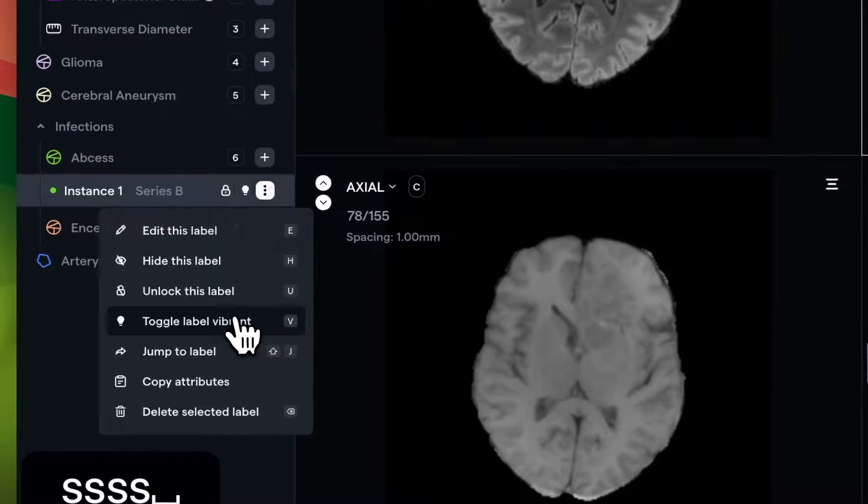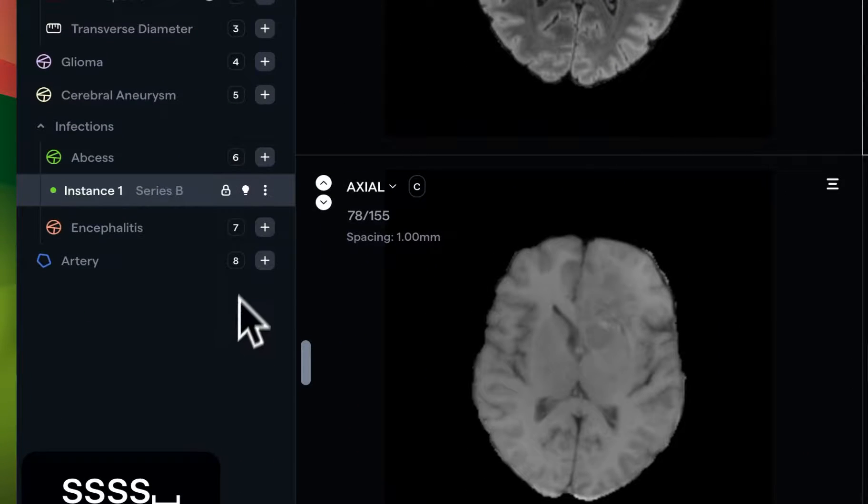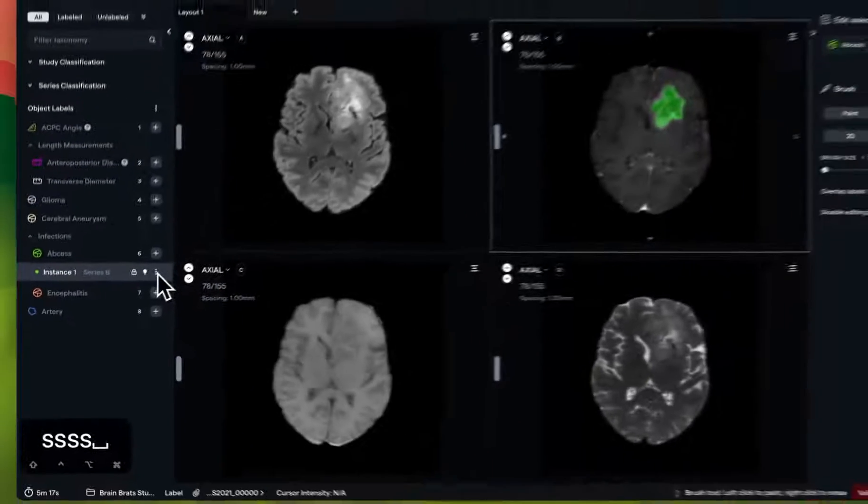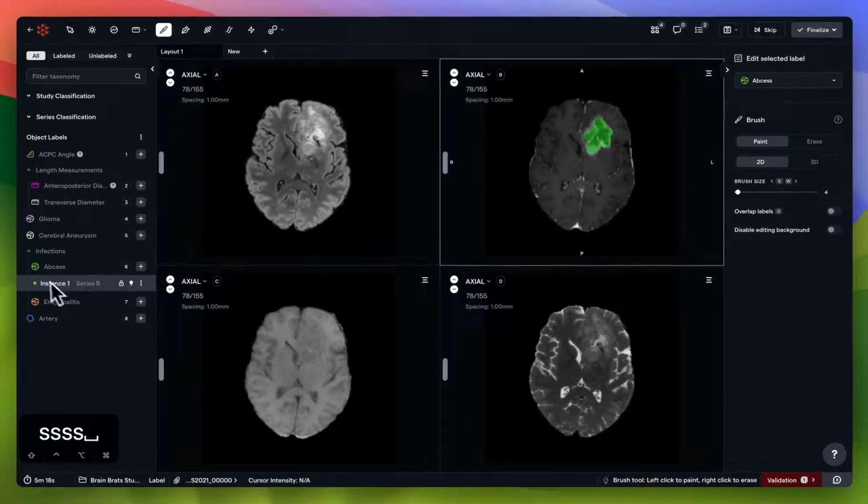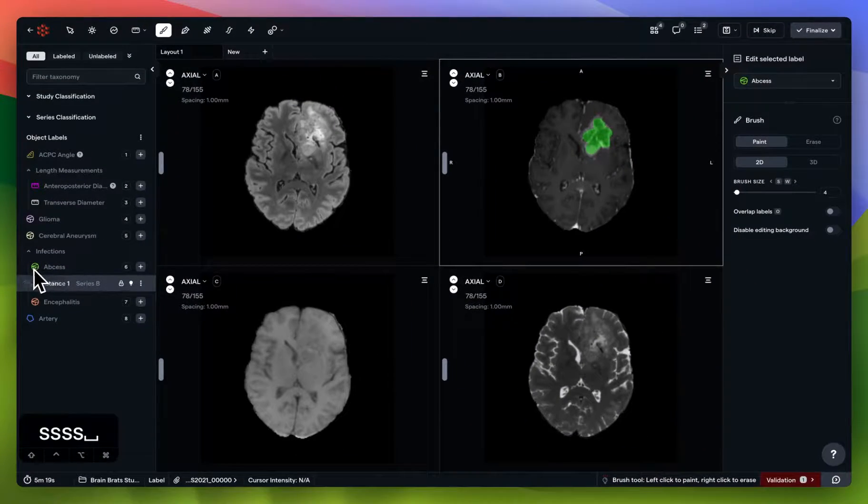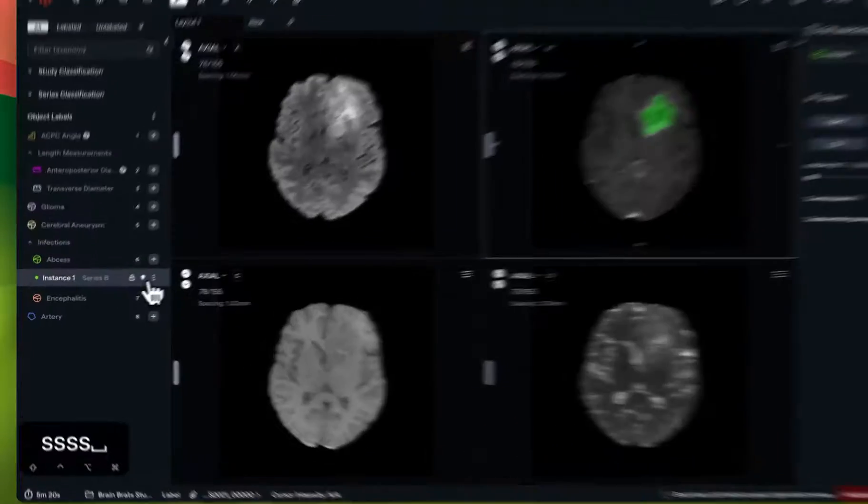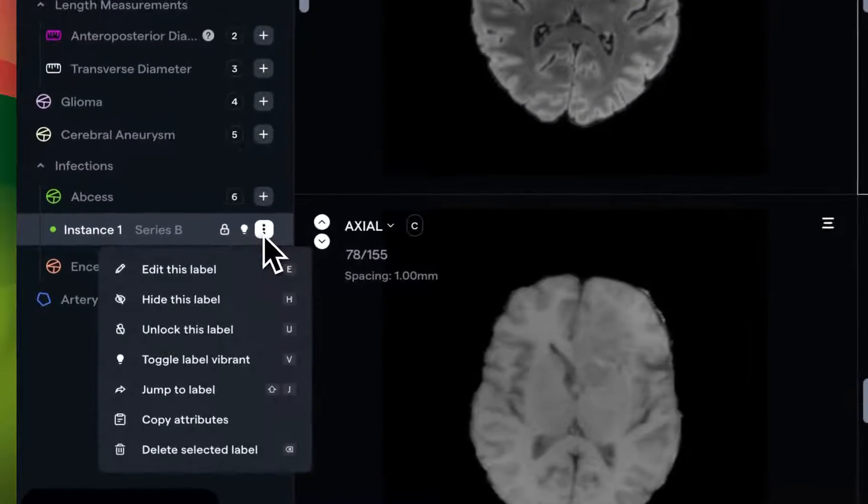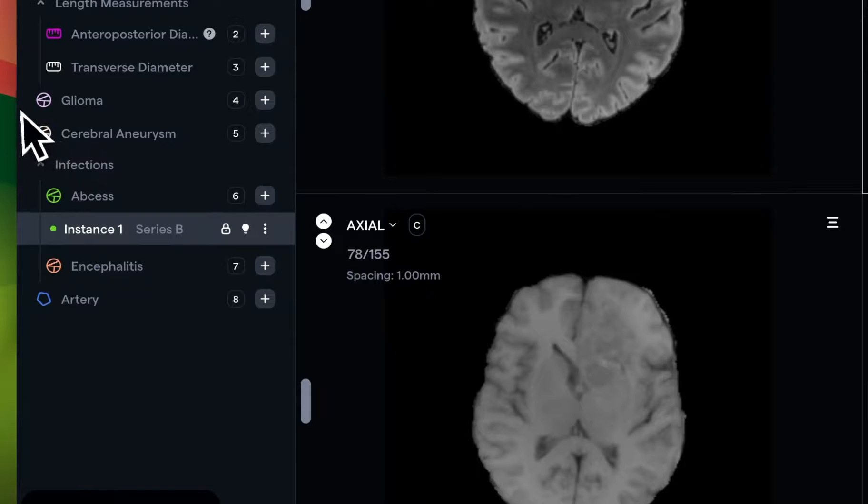You can toggle highlight, which turns it to a bright green. Not a particularly great example, given the abscess itself is green, but it's much more visible with these other pastel-type colors.